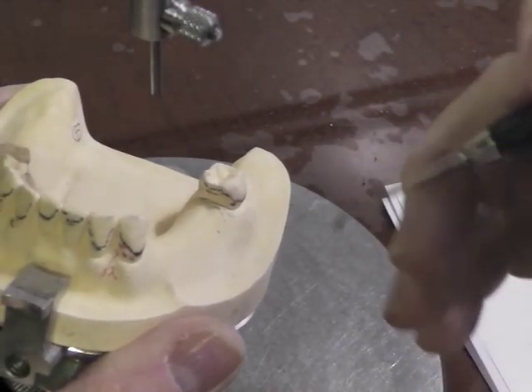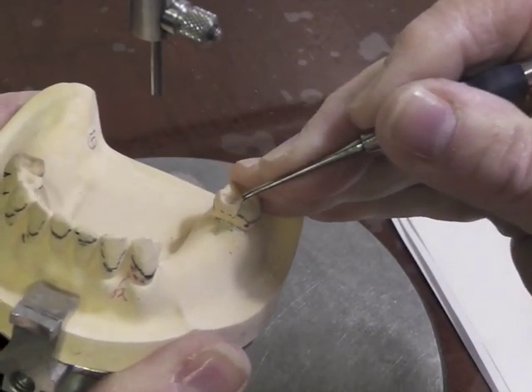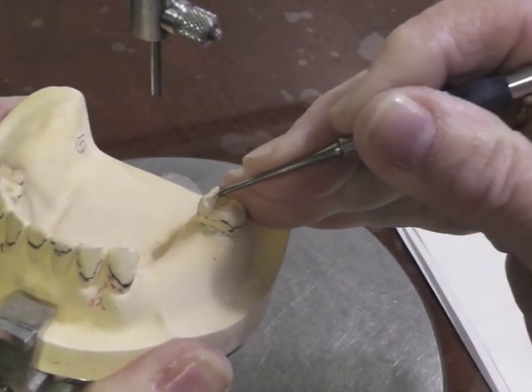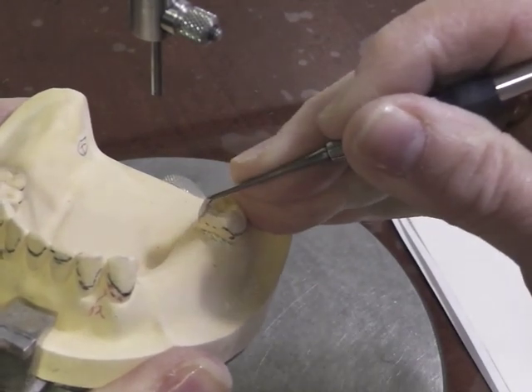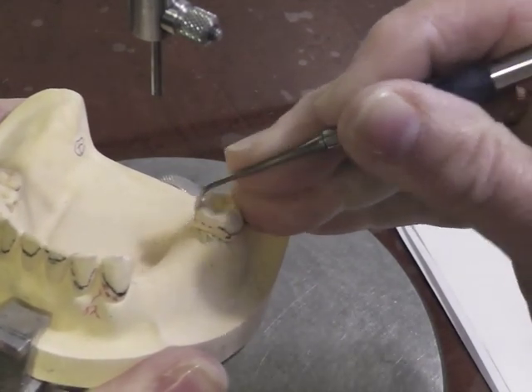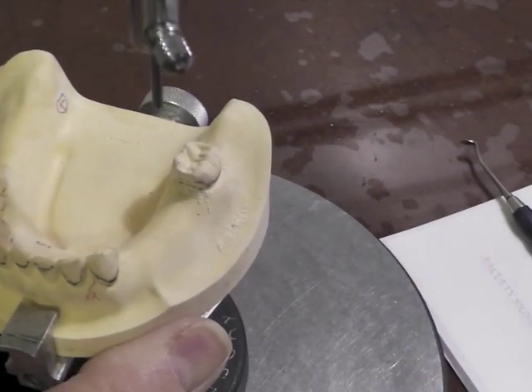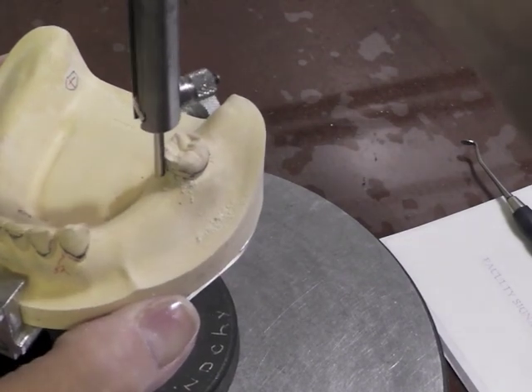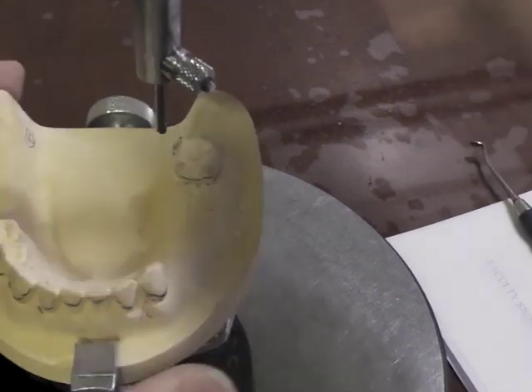I am trying to lower my survey line from this position down a couple of millimeters. So I have to prepare a parallel guiding plane. I can't do that in the mouth with my surveyor obviously. So I'm going to be using this cleoid-discoid to see if I can lower my survey line down to that two to three millimeter mark. And I have achieved that.